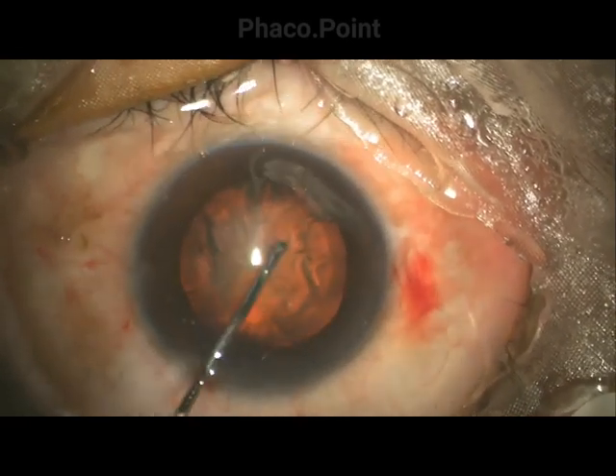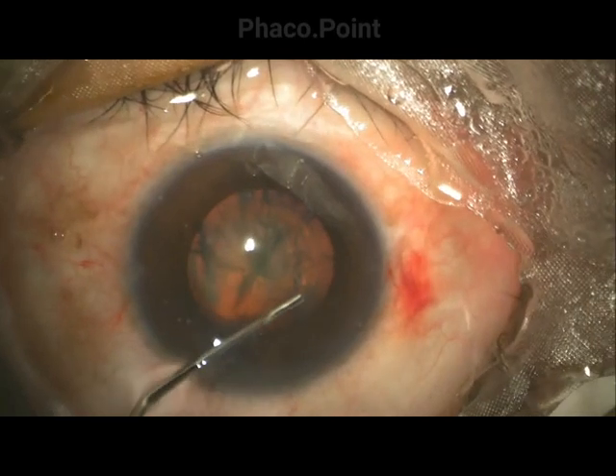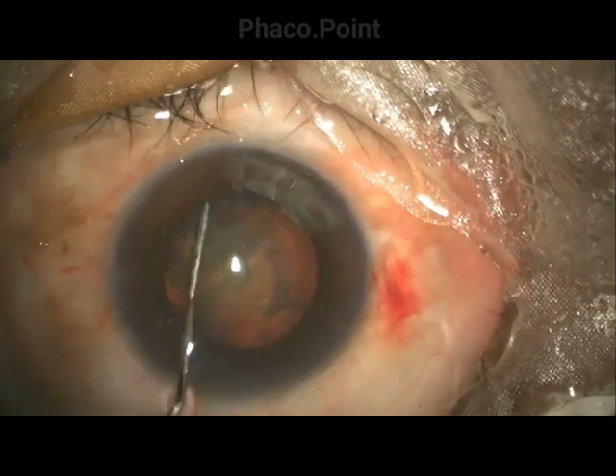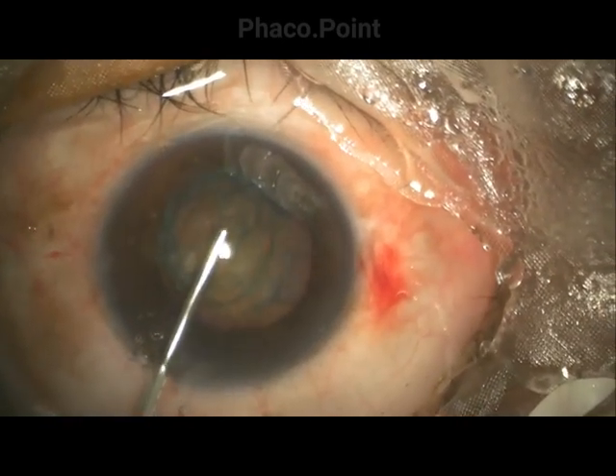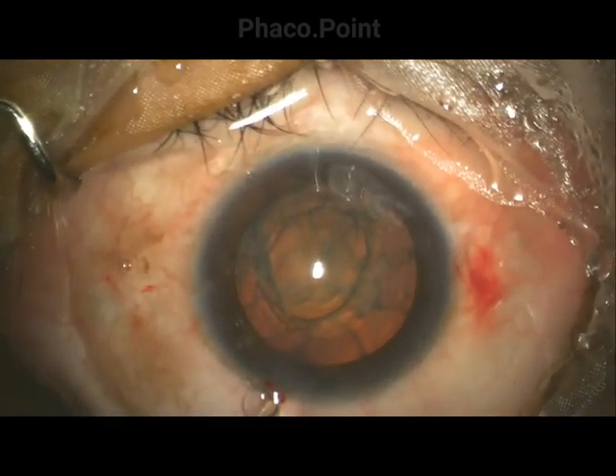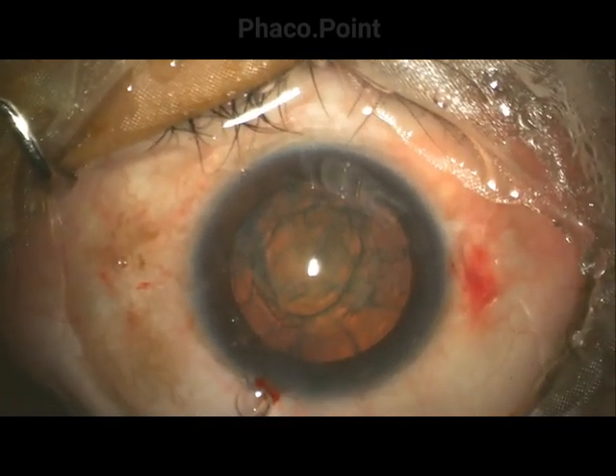After the first injection the nucleus is decompressed, and the same procedure is carried out at another point. Generally, two injections is adequate. Viscoelastic is then introduced into the anterior chamber before performing a rotation of the nucleus to confirm adequate and complete hydrodissection.